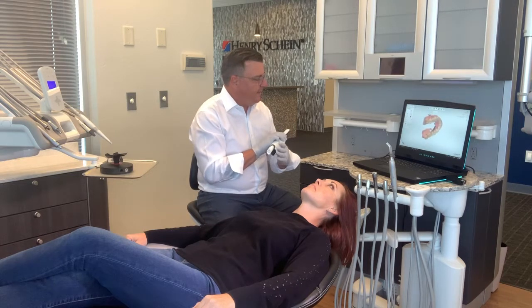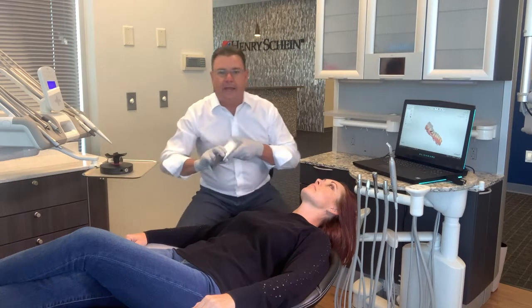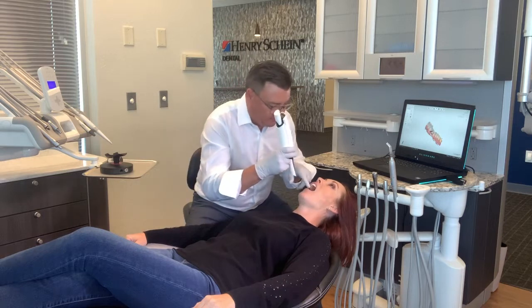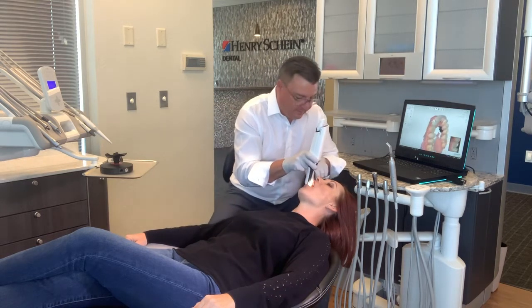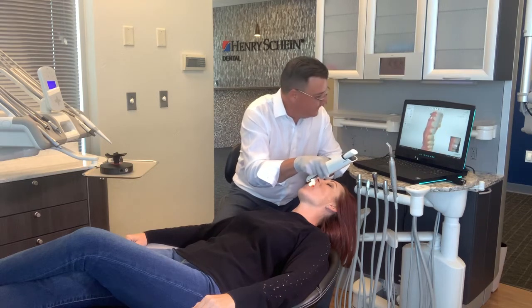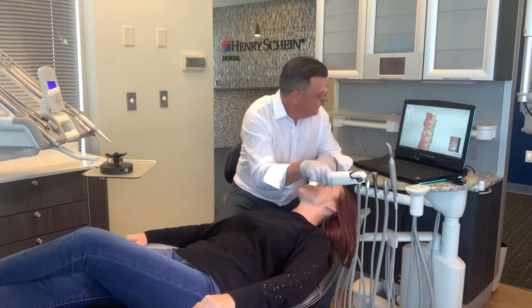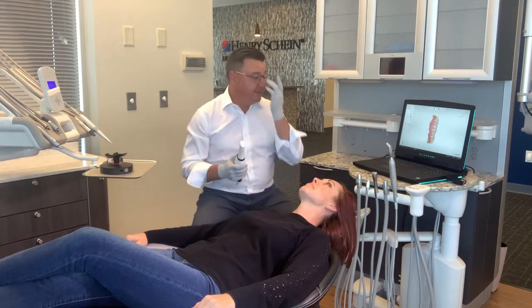For some reason, I am just missing a little bit on that facial side. To add more information, it's as simple as clicking the scanner back on and going back in to capture that. Start in a known area, take a nice steep roll right here, and then fill in the data points that we're missing. Just that simple.